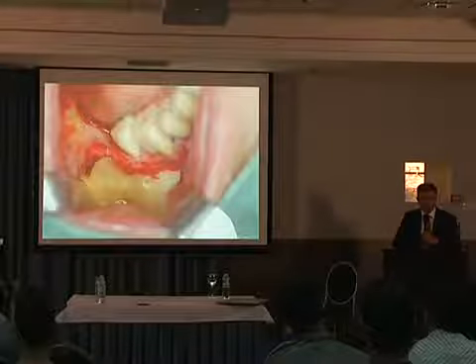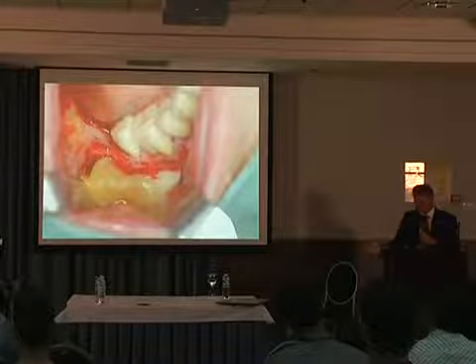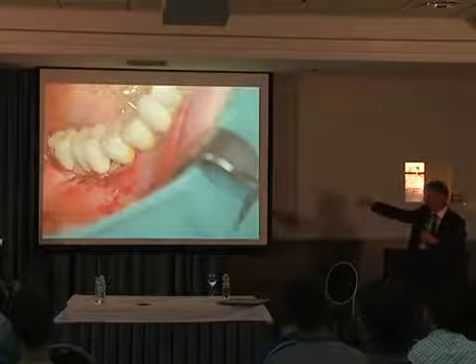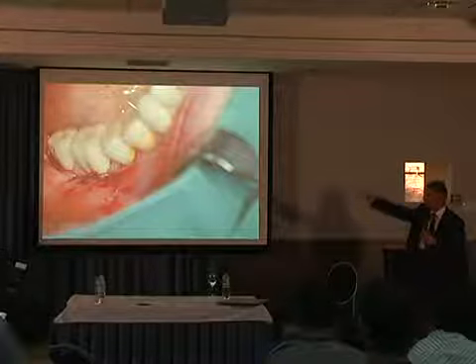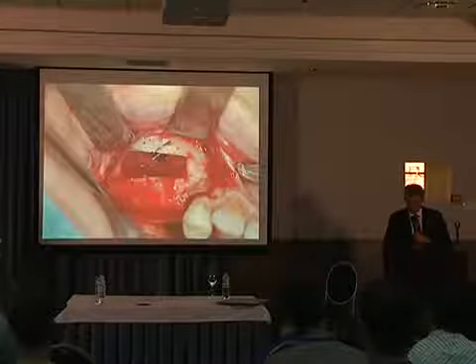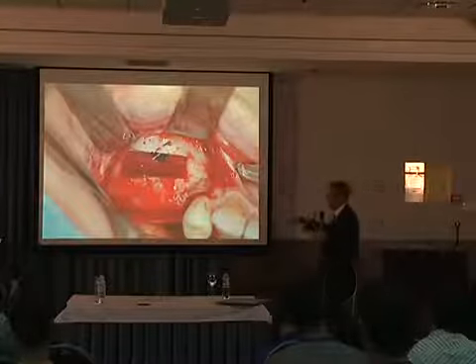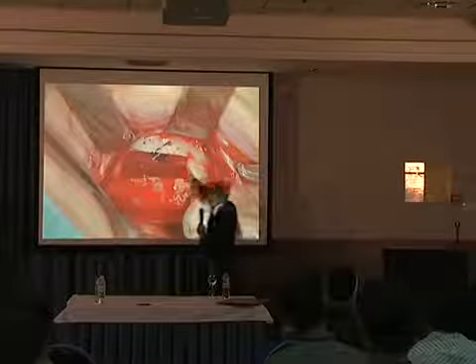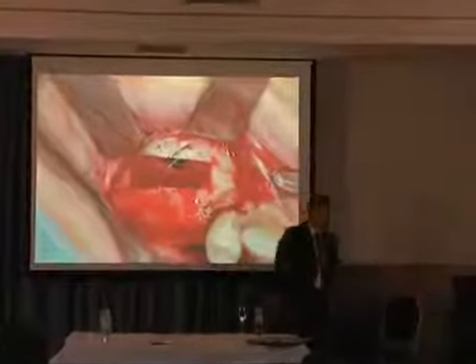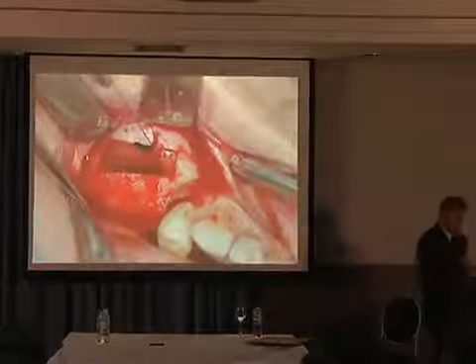Some PRGF inside. Немножко положили, better healing. Богатой факторами роста для заживления. No drainage anymore, just close it. PRGF, без дренажа, без ничего, закрыли просто и ушили. Then stitches of the Schneiderian membrane. Потом зашили мембрану Шнайдера, вот это отверстие, которое было. One mesial, one distal of the defect. Один с мезиальной, один с дистальной стороны.